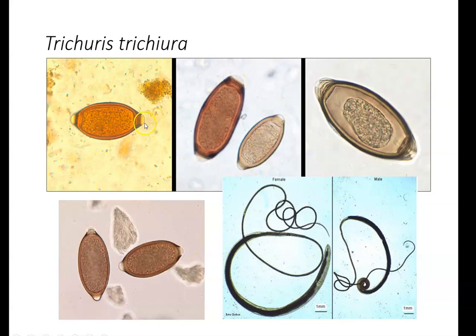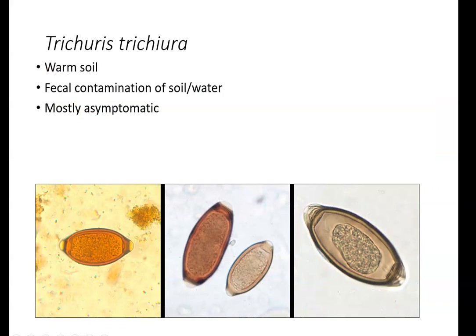This is an actual iodine wet mount right there. And as you can see, they're very dark, no matter what they're in, whether it's iodine or not. Most people don't even know that they have it, so if we find them, it's a big surprise to them. All you have to do is give them some medication and it'll take care of it.